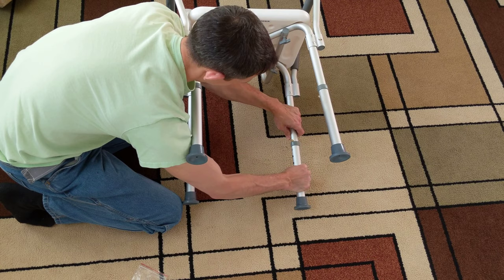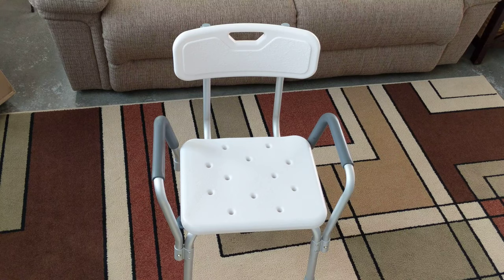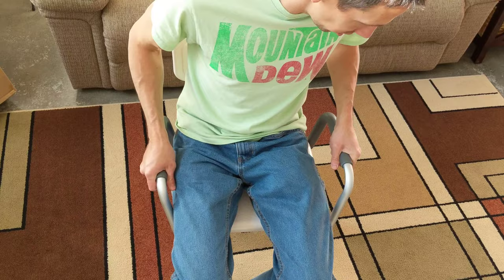Ta-da! We have it. That was not too bad. Alright, let's see if it'll hold me — 250 pounds. Oh yeah, it seems pretty sturdy actually.